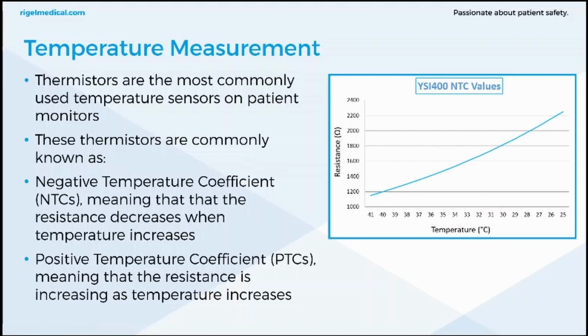And to simulate, which I'll probably repeat myself a bit later on, you're just using resistance set values. So if you want to simulate 41 degrees, you're going to use this resistance here. And if you want to simulate 25 degrees C, then you're going to use a resistance of this value. And quite often a patient monitor service manual will just specify a resistance rather than a temperature.